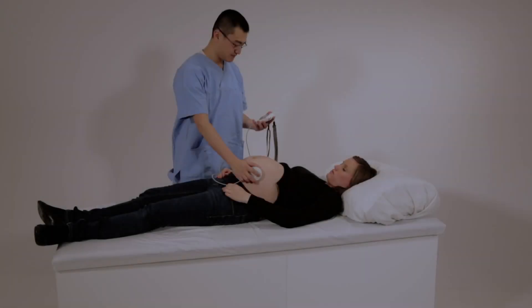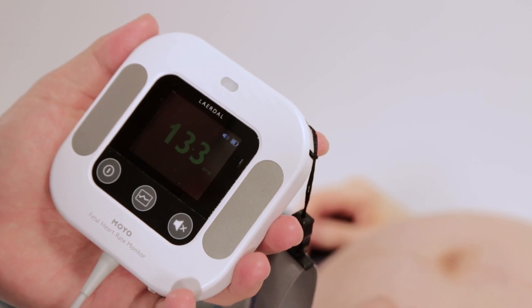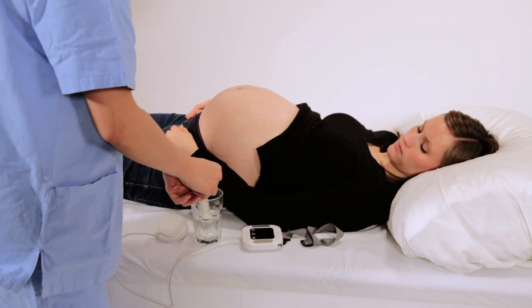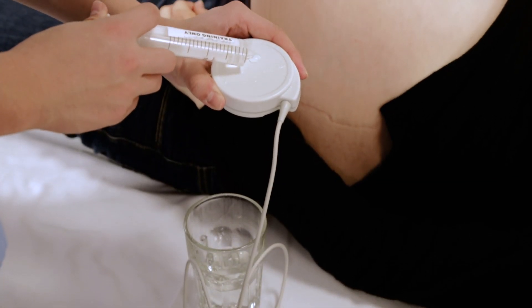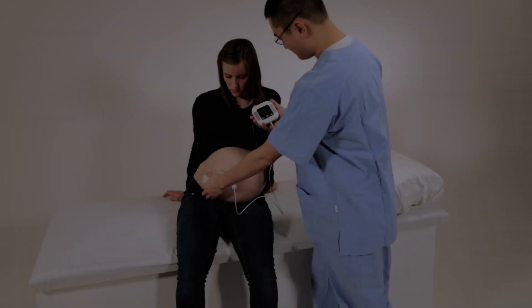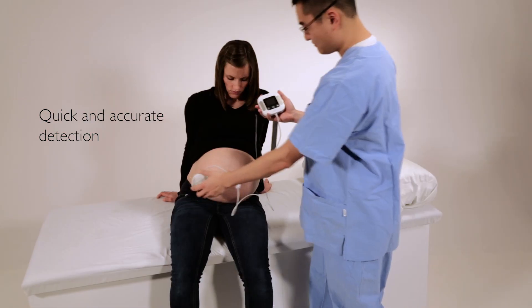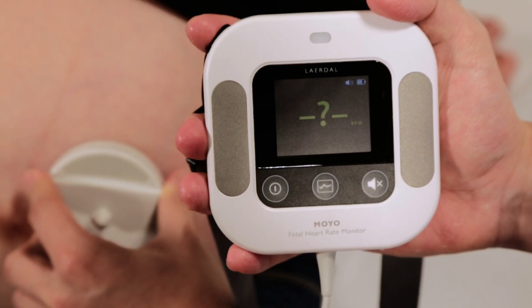Both the mother and the healthcare worker can hear the sound of the fetal heart rate. If gel is not available, water can be used for short-term monitoring. A nine-crystal ultrasound transducer accurately detects the fetal heart rate within seconds.